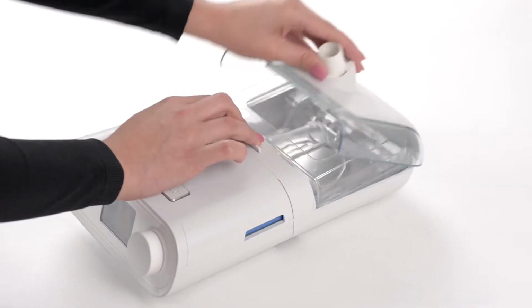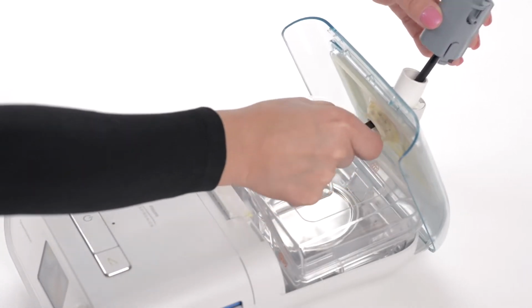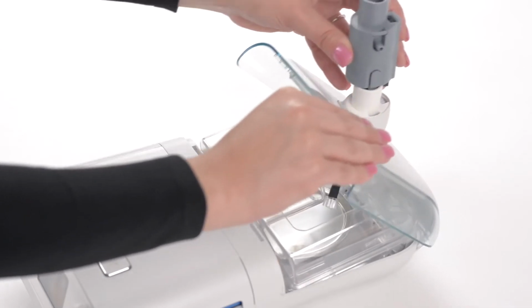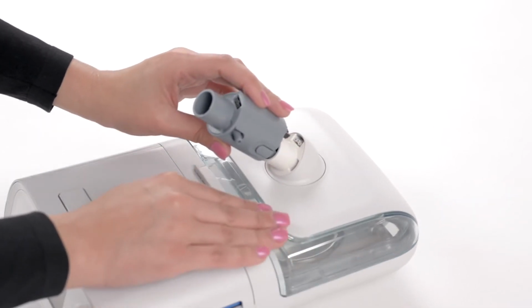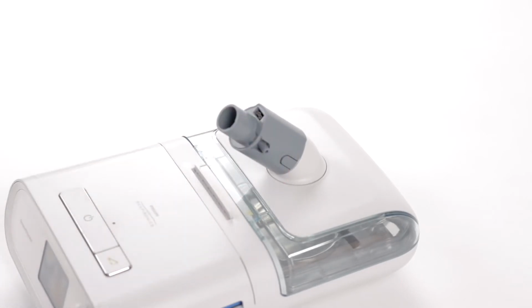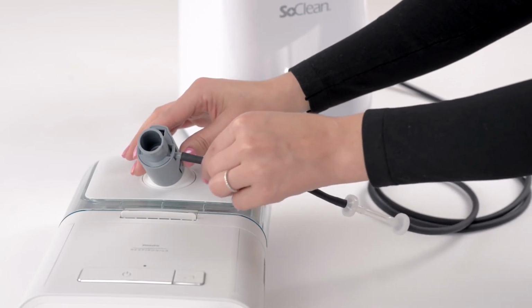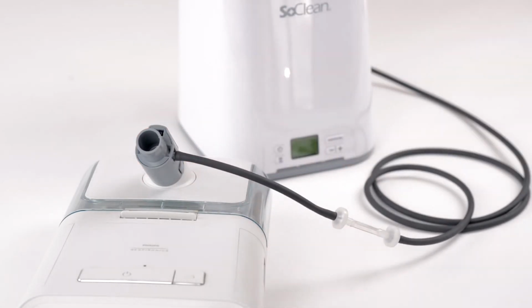Open the reservoir lid. Feed the injection hose down into your reservoir through the port. Close the reservoir lid. Attach the adapter to your reservoir. Do not detach the injection hose from the adapter at any point. Connect the main hose from the Soclean to the stem on the side of the adapter.